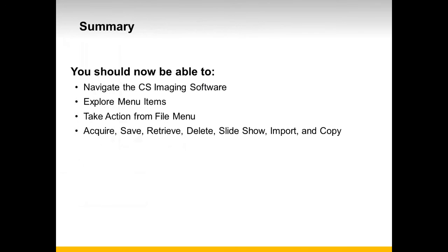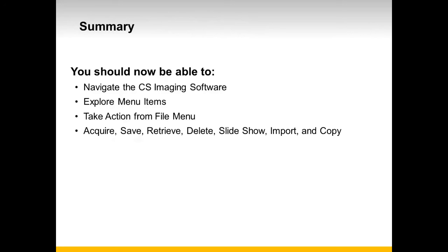This concludes the Navigating the Software recorded class. You should now be able to navigate the CS Imaging software, explore the menu items, take action from a File menu such as acquiring, saving, retrieving, deleting, using the slideshow feature, importing, and copying.